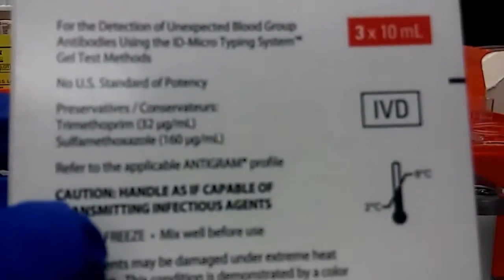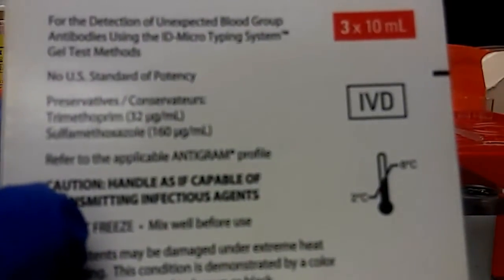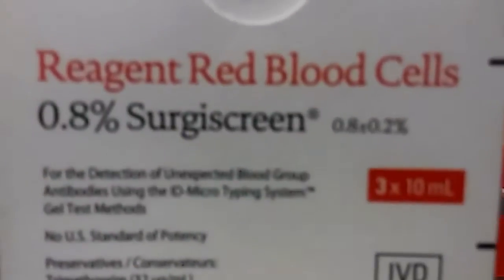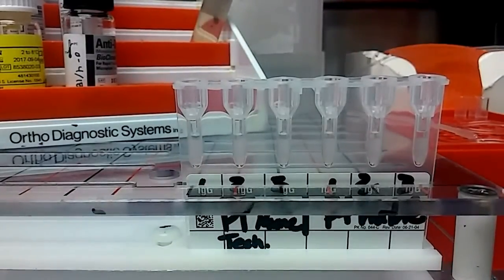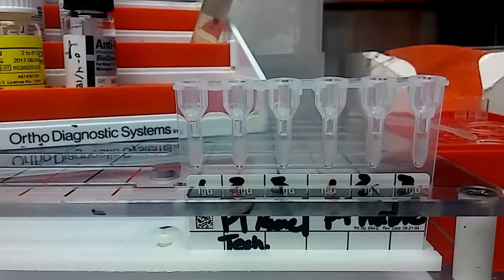The cells we're going to be using are the Surges Screen, and there are three bottles for one, two, and three. They each have different antigens to help figure out the antibodies. This will catch most antibodies, but there are specific examples that it won't always get. These are a screening test, so from here you would do the workup to figure out each specific antibody.